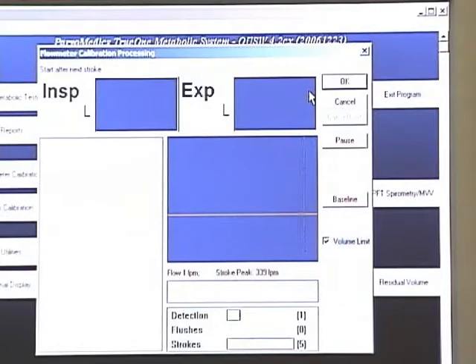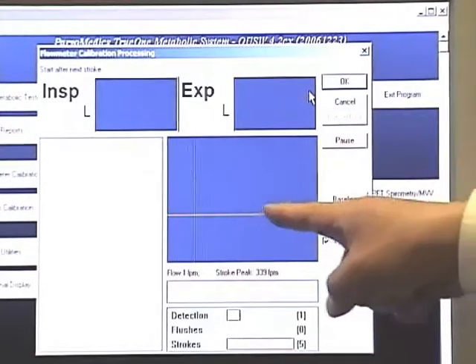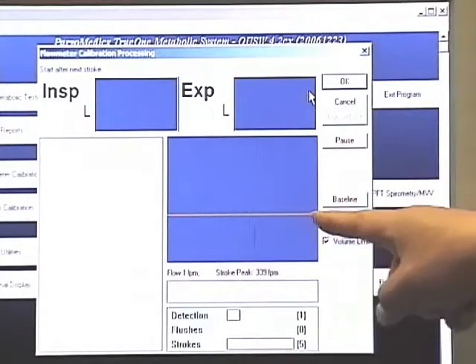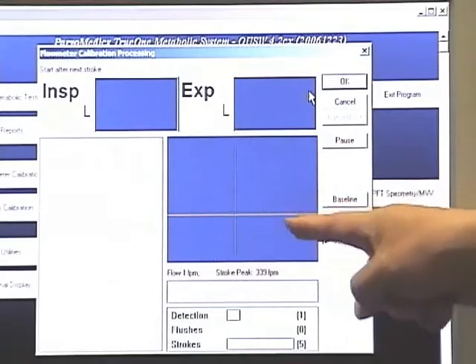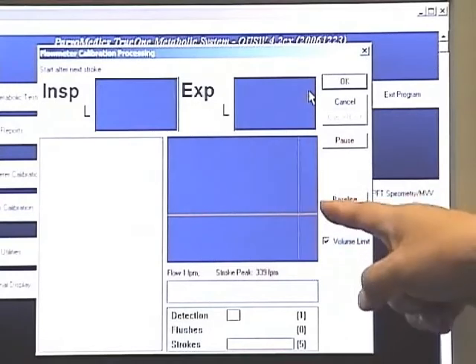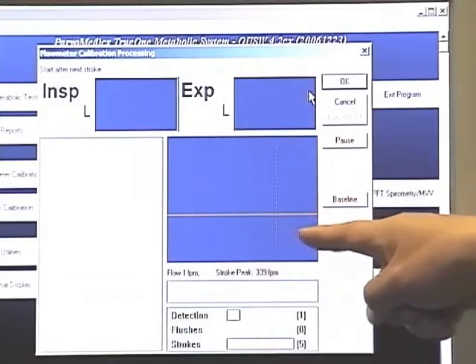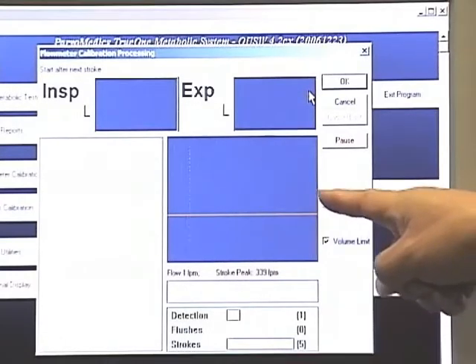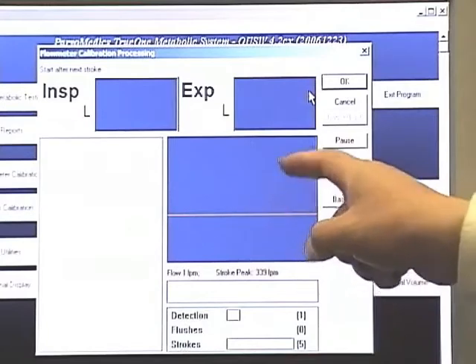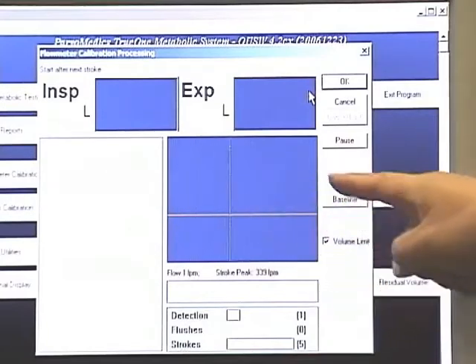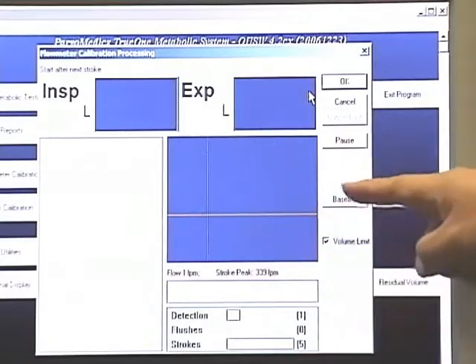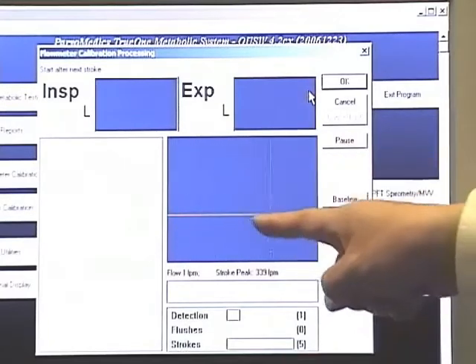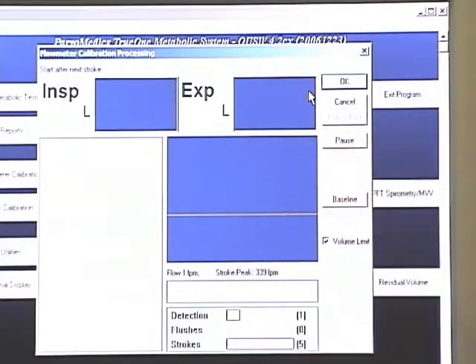We should start inspiratory about one-fifth at the bottom, expiratory one-fifth, then inspiratory about two-fifths and expiratory two-fifths. We just loop bigger and bigger, and here the expiratory reached 600 to 800.